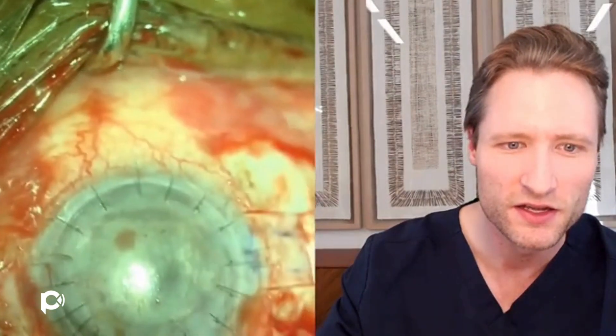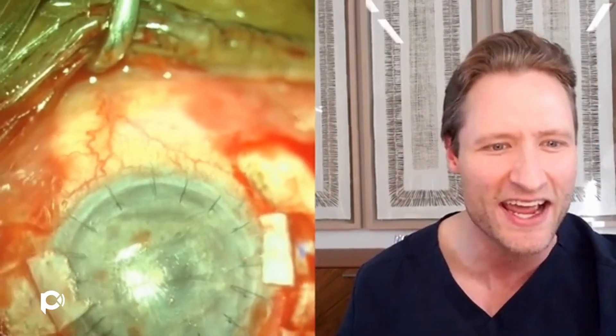You have one flap on either side of the eye for symmetry purposes. At the base of this flap, about a millimeter or a millimeter and a half from the limbus, you make a sclerostomy — this is with a 26-gauge needle diving straight into the back of the eye. You'll notice when I puncture into the eye, I get this gush of fluid because the eye has been under pressure from aqueous misdirection. Fluid is being produced and it can't get through the scarified pupil, which is encased in an anterior lenticular membrane. Once I've decompressed the posterior segment, it becomes possible to reform the anterior chamber.